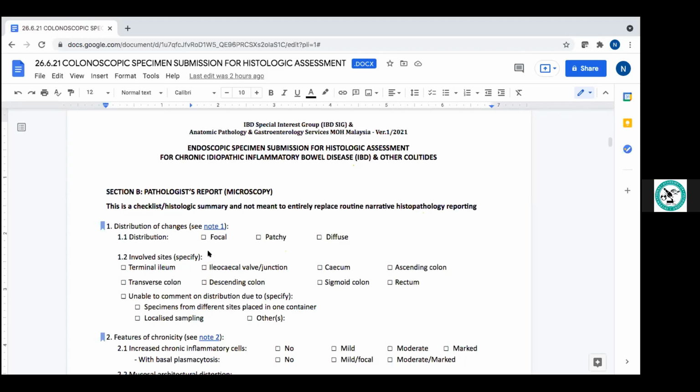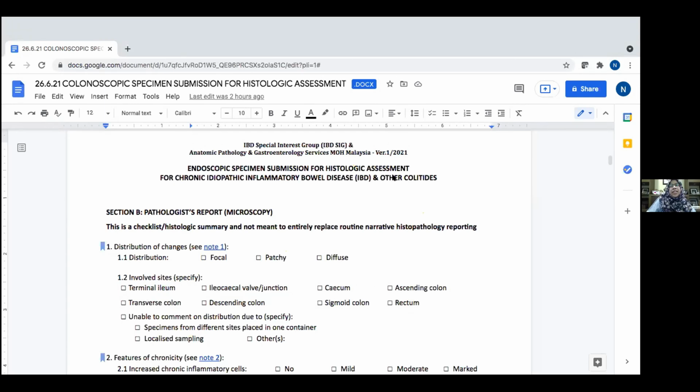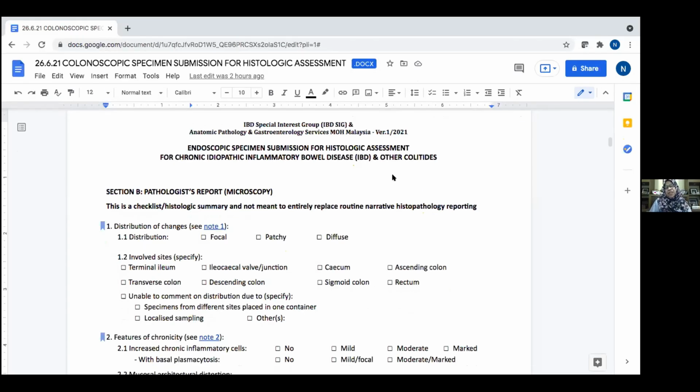Right. This is from Dr. Suguna again. Do we need to do CMV antigen IHC in a persistent active disease despite being on treatment, or in superimposed acute colitis picture in IBD cases, even though we don't see inclusion on H&E? Yes, I quite routinely do CMV immunostain for IBD cases on treatment, but with persistent inflammation or not responding, or suddenly develop flares. You do want to exclude concomitant superimposed CMV infection.